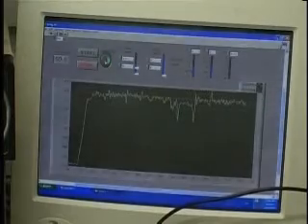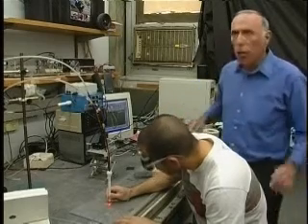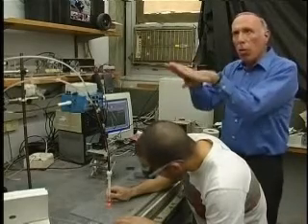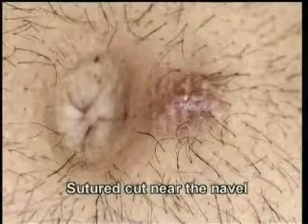What you can see here is that the temperature is roughly 65 degrees centigrade, and at this temperature the cut will be bonded. Both the edges of the cut and the albumin all stick together, and the advantage is that you get, first of all, a strong bond instead of sutures.